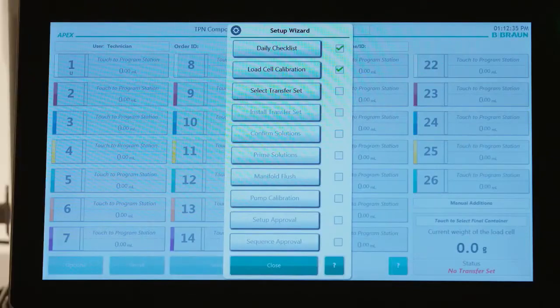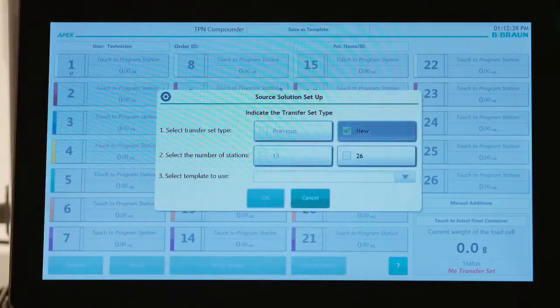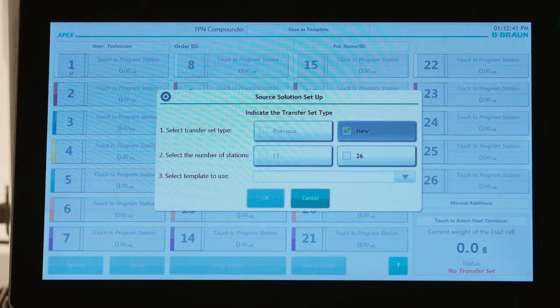To begin the process of selecting a transfer set, tap Select Transfer Set from the Setup Wizard. The Source Solution Setup screen will open.